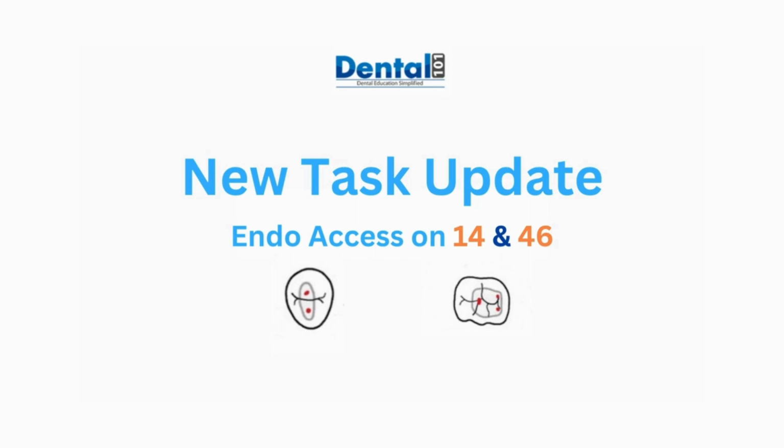Today I would like to bring your attention to the new technical tasks that have appeared in the ADC Part 2 this week. So let's talk briefly about them. As you all know, so far there have been two new tasks, especially in Endo, which has been the 1-4 and the 4-6 access prep. So let's go over them with a few points to bear in mind.